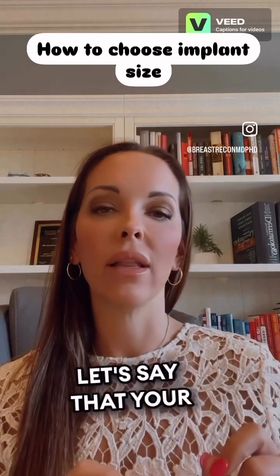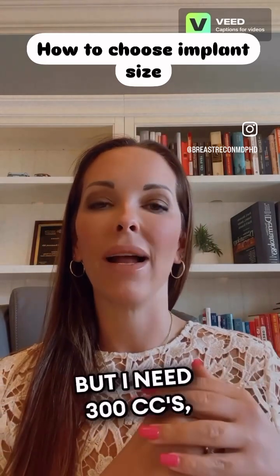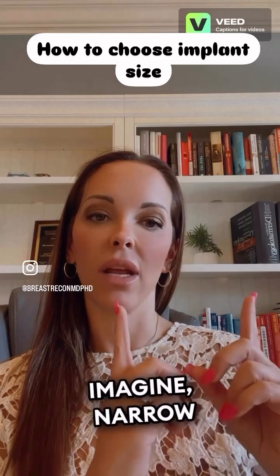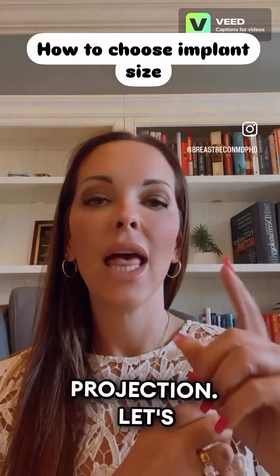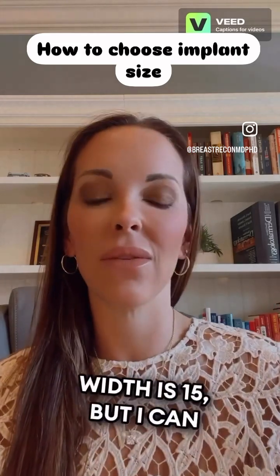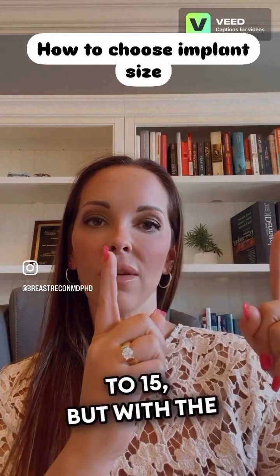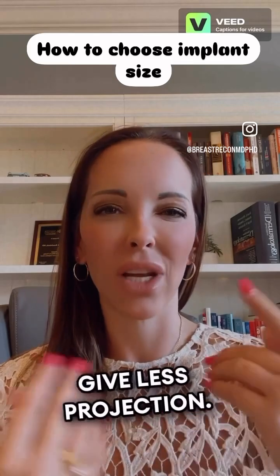Let's do an example. Let's say that your base width is only 13 centimeters. That's a very narrow base width, but I need 300 cc's, which is about a can of soda, to fill your breast. As you can imagine, narrow width, big volume is going to have a high projection. Let's contrast that to a wide base width. Let's say your base width is 15, but I can only fit 300 cc's. As you can imagine, taking that 13 centimeter base width to 15, but with the same volume is going to give less projection. Does that make sense?